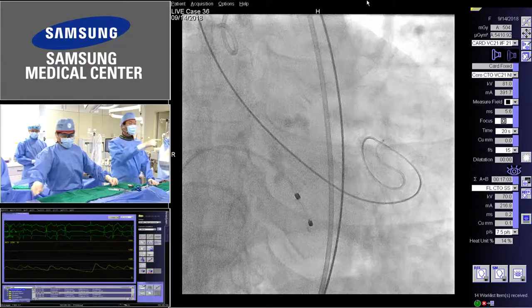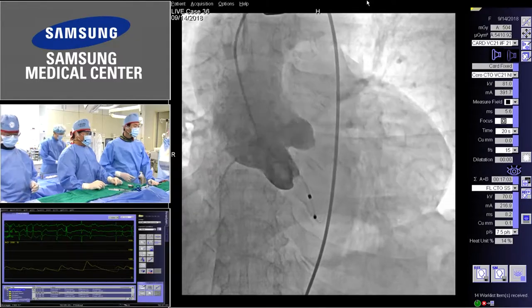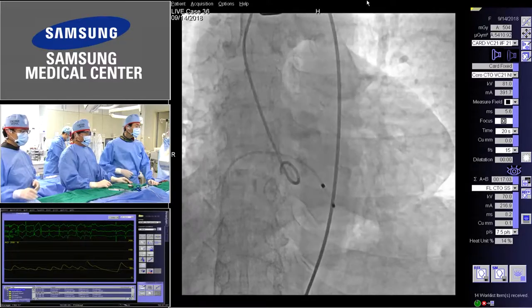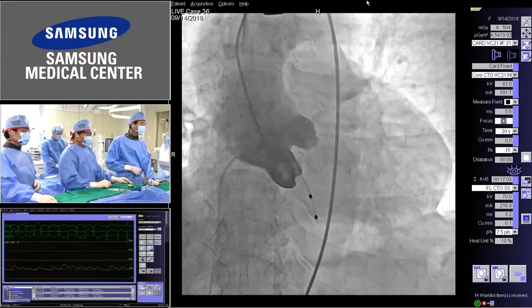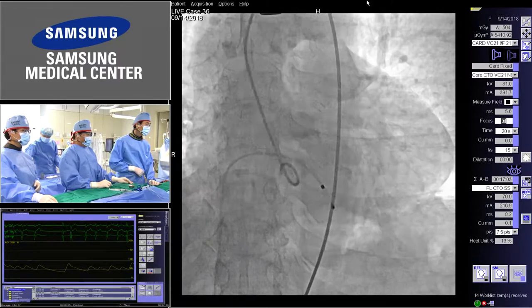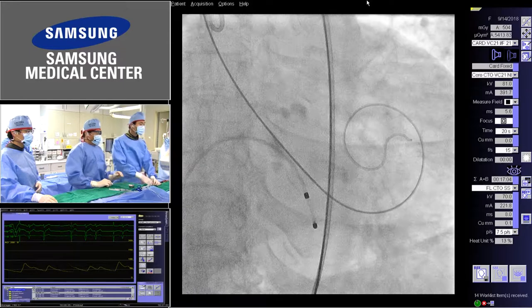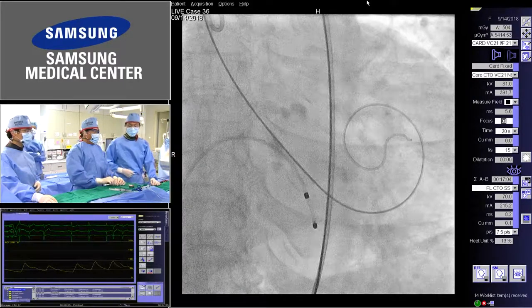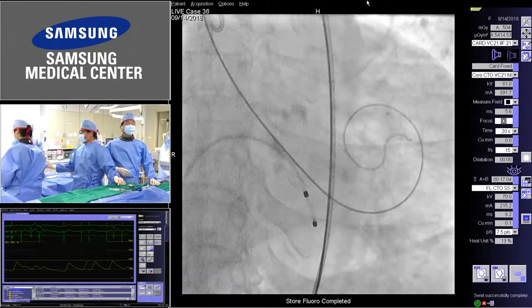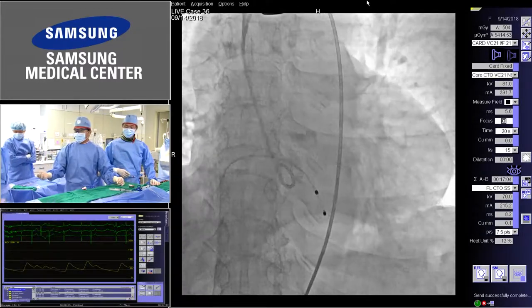Can you show us this? Yeah, and your plate. Now, in this very special case, I would consider, very rarely, I admit, a balloon inflation. Just because, in spite of the fact that you say again and again that there is no huge calcification, there is a piece of calcium there in the left coronary sinus that, when the balloon is inflated, is going to be pushed into the left coronary sinus. I would like to see, the way I'm learning, if I can test that with your recommended balloon, the predilation, the movement of the calcium. So, to the predilation? Yes, please. Okay, we can do that.